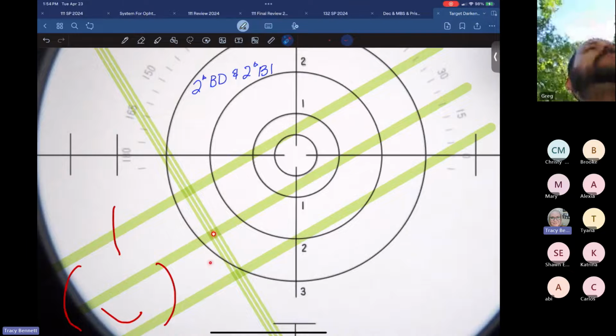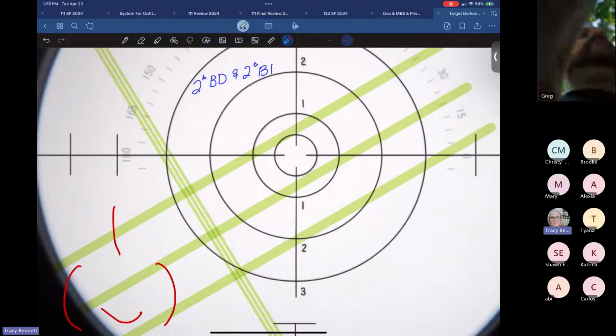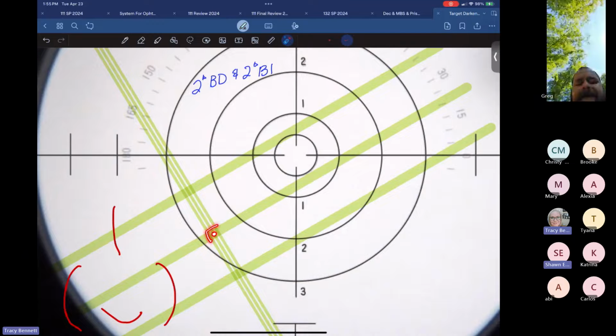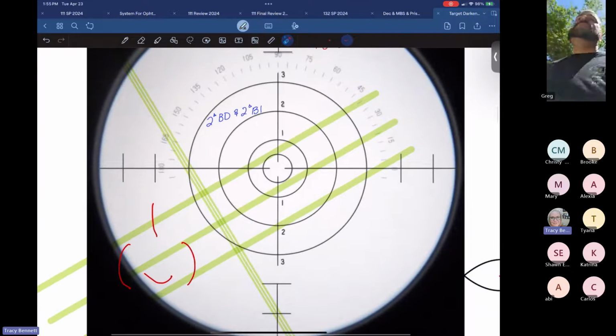And this point is pretty much aligned with the 2 base in. So we're still looking at all the same things, our main point, and we're still just going vertically and horizontally to figure out how far away from here we went on a vertical and a horizontal.